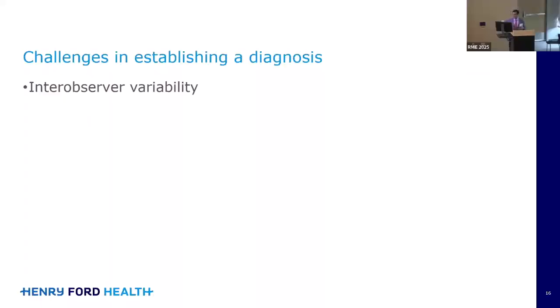What are the challenges in establishing a diagnosis for hilar strictures? We've talked about it a little bit over the course. And I think CRM might have mentioned it. Carlos mentioned it on the call when he was doing a case yesterday. There's substantial inter-observer variability, even amongst the world experts, about what constitutes a malignant stricture. There's variability in experience and expertise in calling out what's a tortuous, irregular branched vessel. Particularly, when I read people's cholangioscopy notes, I often note that there's a lack of the language that's used appropriately to describe what's a high-risk lesion.